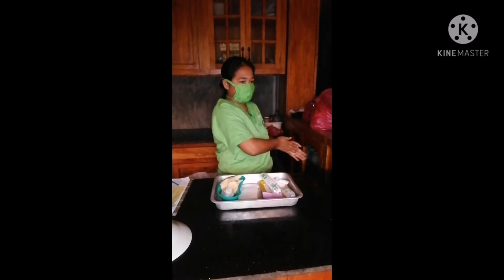Perform hand hygiene. Move the medication cart to the outside of the patient's room or prepare for administration in the medication area. Prepare medication for one patient at a time. Read the medication administration record, or the MAR, and select the proper medication from the patient's medication drawer or unit stock.